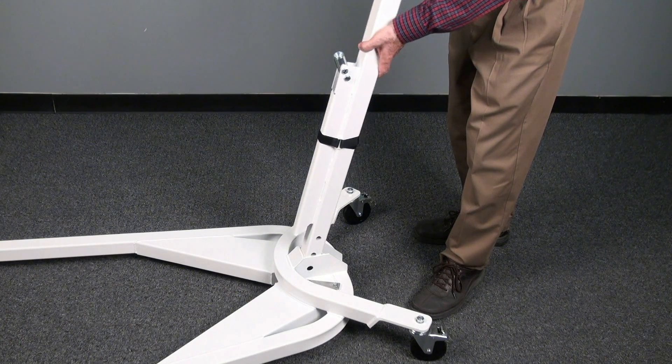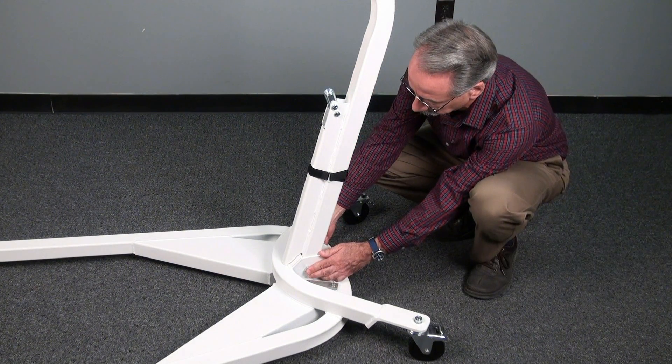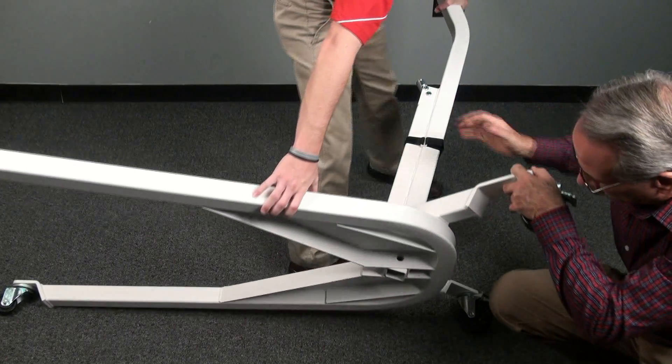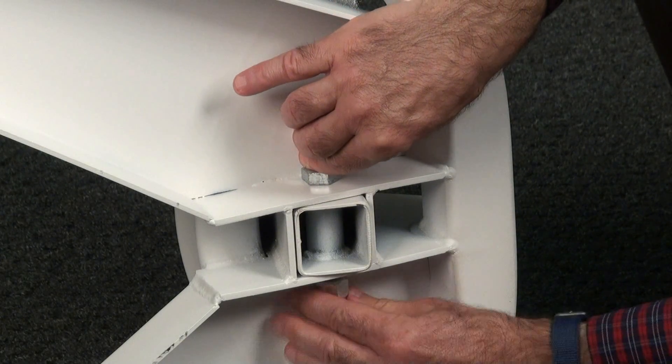Once locked into place, simply slide the column into the bracket on the base and install and tighten the top bolt. With assistance, turn the base onto its side to install and tighten the bottom bolt.